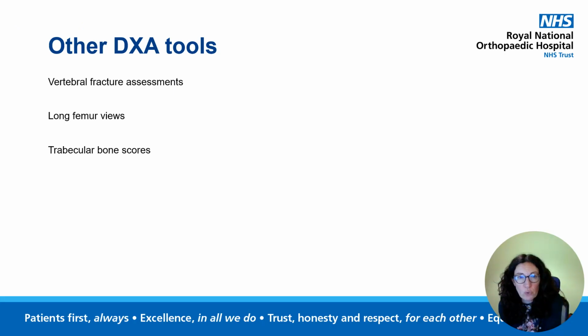What about other tools? There are other things we can start to use DXA for. Vertebral fracture assessments can be really helpful. There are guidelines around who should have those, and I'm aware of many services, mine included, that struggle to incorporate vertebral fracture assessments. You may be doing some long femur views.